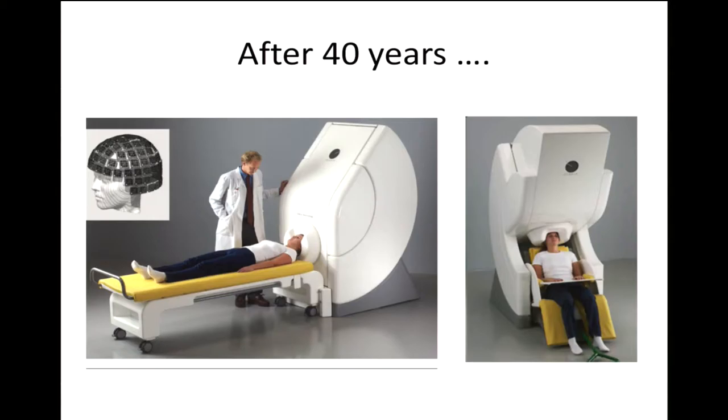locations. So if you use a similar analogy, with EEG we have electrodes, but in MEG there is no electrode. These are 102 locations, and each location has three pickup coils. And now you can combine whether you have one magnetometer or two gradiometers. So that's how the MEG looks like.